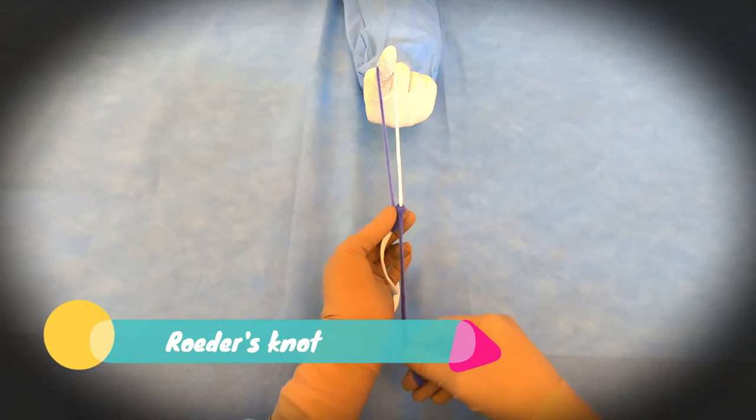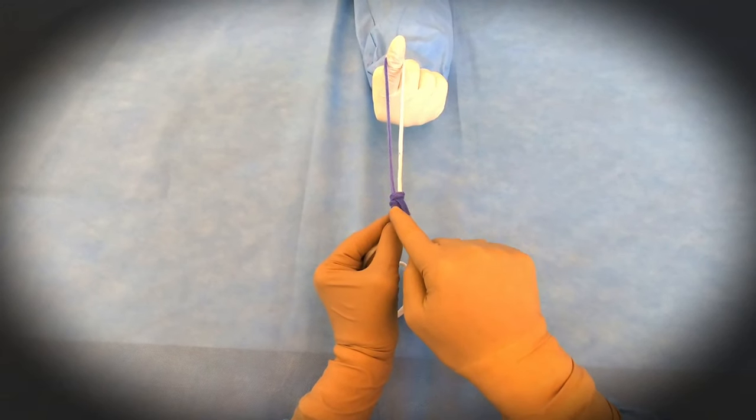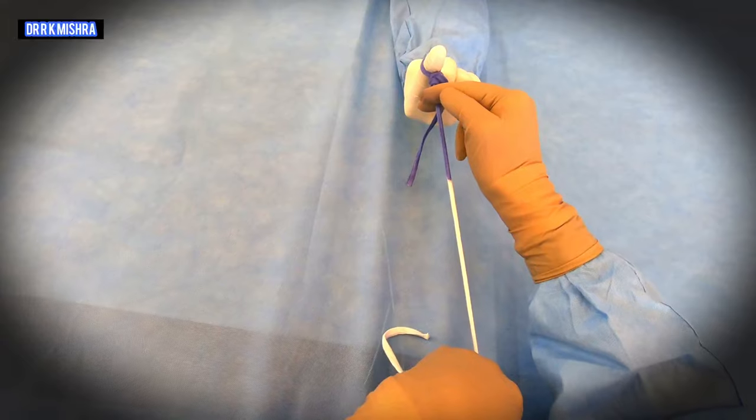After that you will use the closed knot pusher — most commonly the Clarke knot pusher — and you will push. This is the one-three-one configuration, and then you will slide it with the help of the knot pusher.